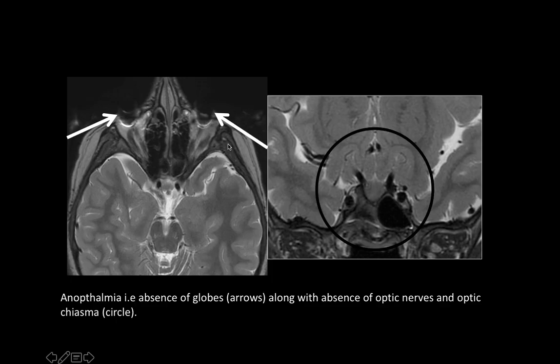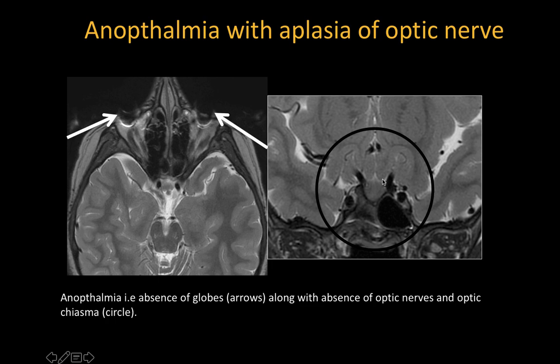Coming to the congenital category, here we see T2 axial and T2 coronal weighted images where there is complete absence of the globe, i.e. anophthalmia, associated with absence of both the optic nerves and the optic chiasm. This is a very rare pathology — anophthalmia with aplasia of the optic nerve and optic chiasm.